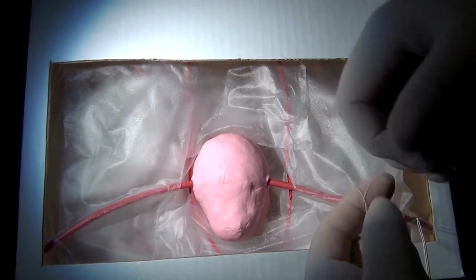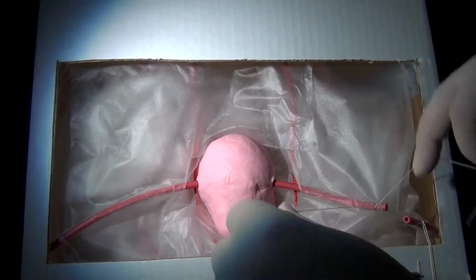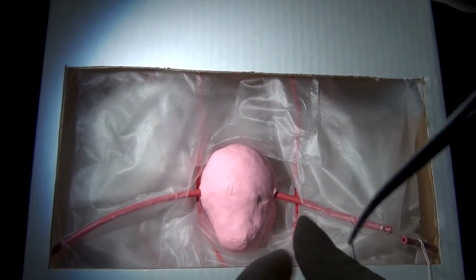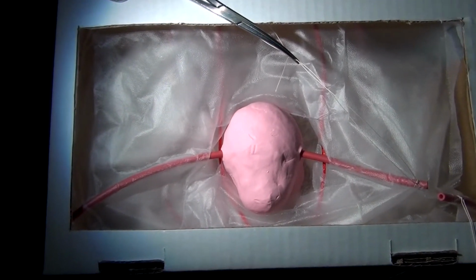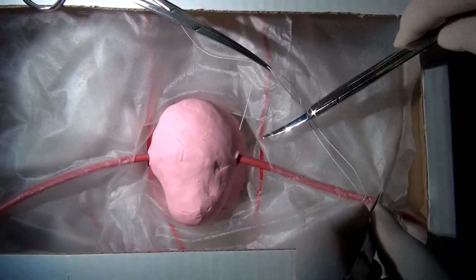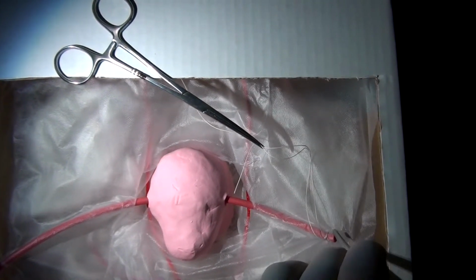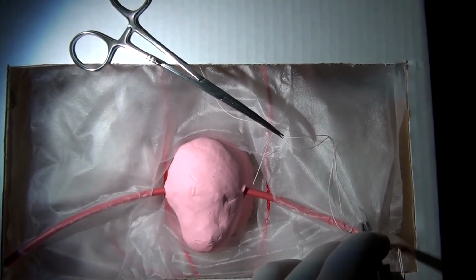And I'll take a hemostat. Suture sticking a little bit to my gloves. Next step, I'm going to take a pickup and Metzenbaum scissors. I'm going to tent up on the posterior peritoneum, and I'm going to open this up. Now in the operating room, your assistant may give you a tonsil to undermine, which makes it easier, but we're going to open this up.